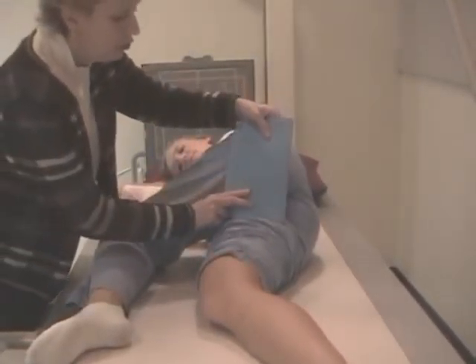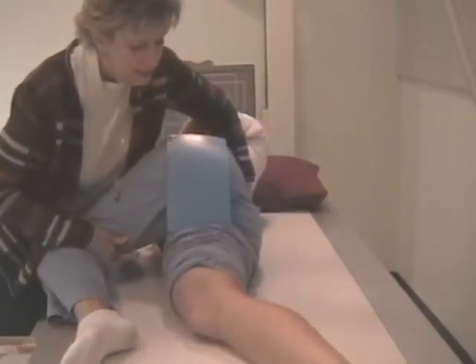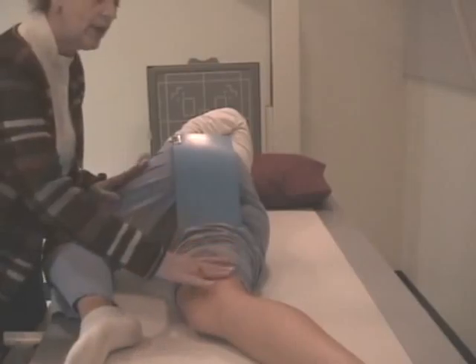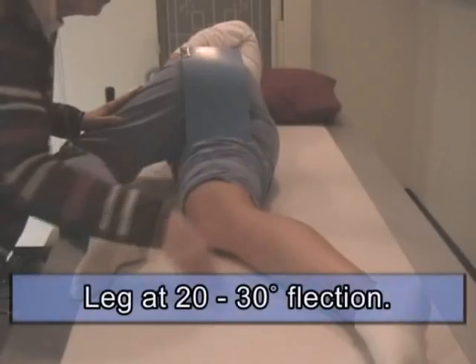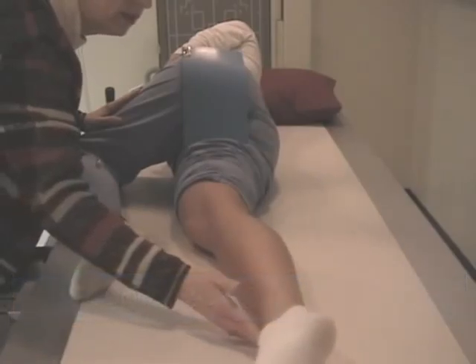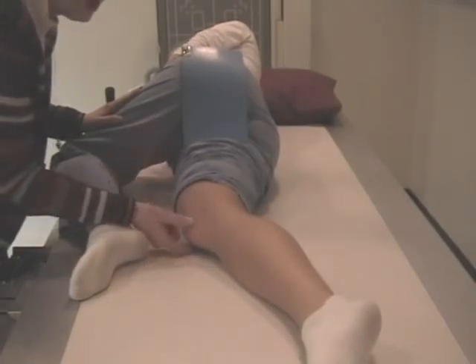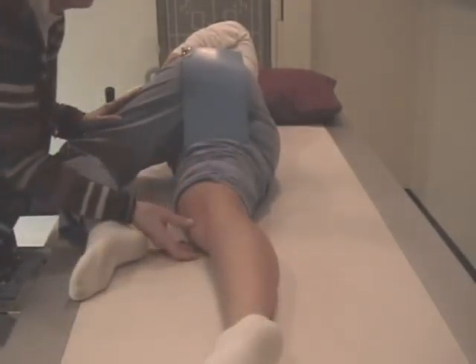You're going to have to readjust your shielding, and the next thing I want to do is slide her hips more towards me to get that femur more straight down the table, and she can get comfortable now. Are you okay? Okay. The femur is straight down the table, and we have the lower leg at a 20 to 30 degree flexion. You don't want the leg straight, in other words. It's a slight 20 to 30 degree flexion. That allows the muscles to relax and the bones will go into a more natural position. If you suspect a patellar fracture, do not flex that leg more than 10 degrees.